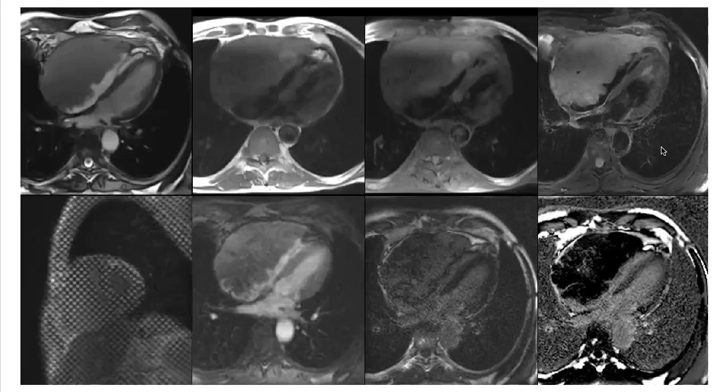Here we see delayed enhancement, and you have to be careful with delayed enhancement. Whenever you're looking at a mass, you want to make sure you do long inversion time recovery images, because we don't want to null the tumor. If the mass has the same amount of GAD in it that the myocardium has, and you pick a time that's going to null the myocardium, you could be nulling the mass. So if you do long inversion times, then you're letting anything that has GAD in it completely recover the signal.